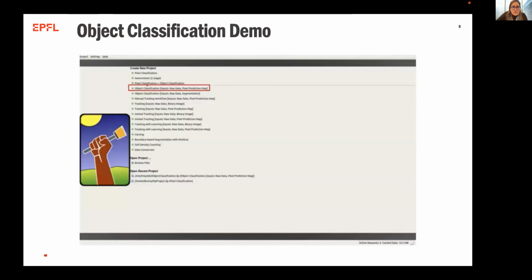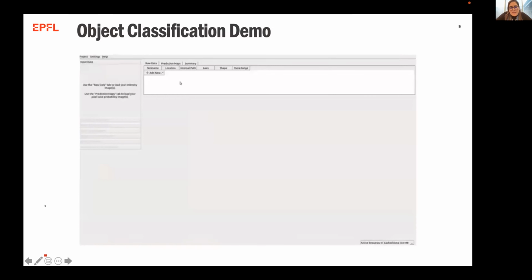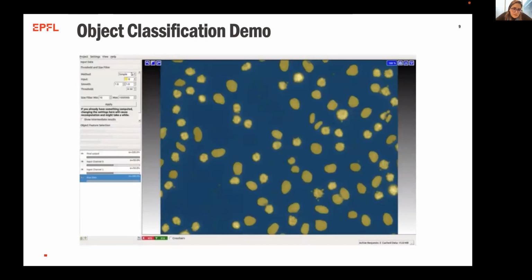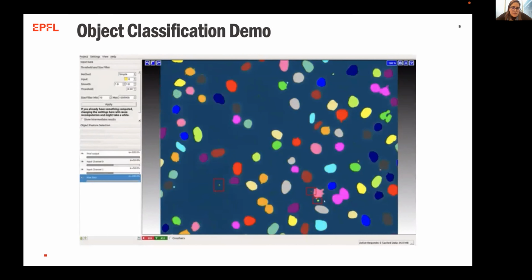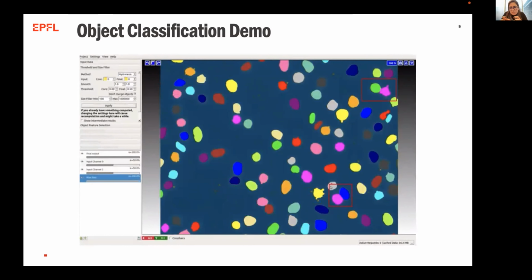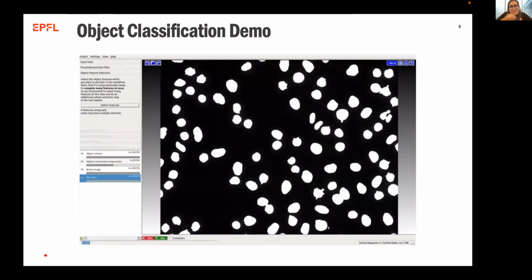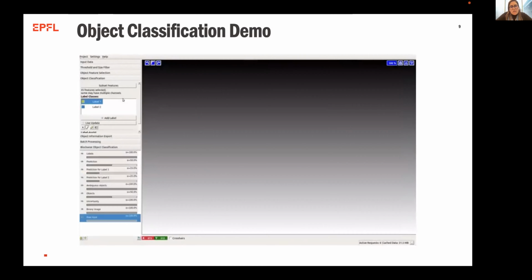And if I move on to object classification, here it will also be quick. You can classify based on pixel classification if you feel that, in this case for example, you can decipher differences within the nuclei. The first step is to import what was annotated with the pixel classification. And then with object classification, we can modulate quite a few parameters in terms of filters and size, or filters that will help us to define boundaries between two nuclei or cells, and then move on with integrating what you want to have as metadata from this object classification.